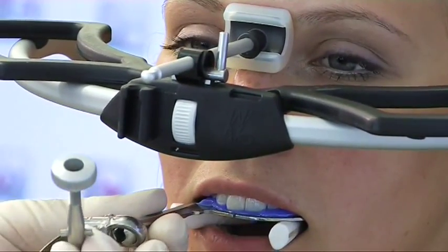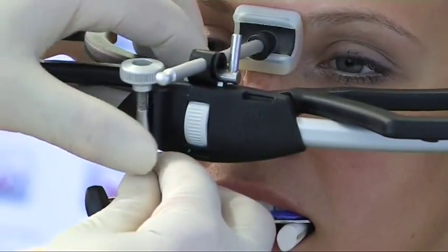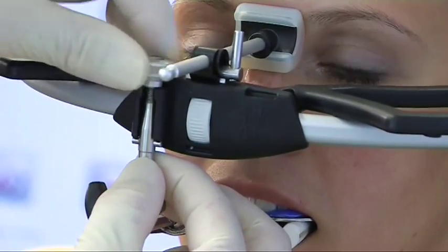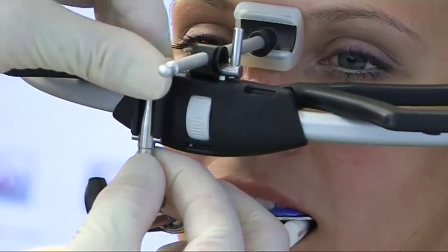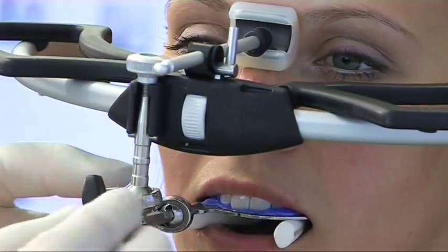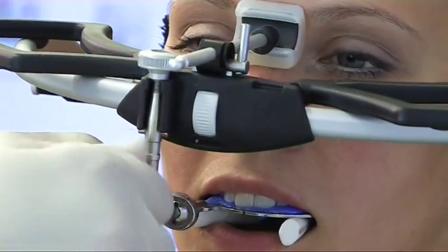Upper jaw model installation with individual centric axis. The clamp is pushed onto the bite fork, inserted, and then firmly screwed in the guide of the face bow. Then, by firmly screwing the clamp, both parts are fixed to each other.